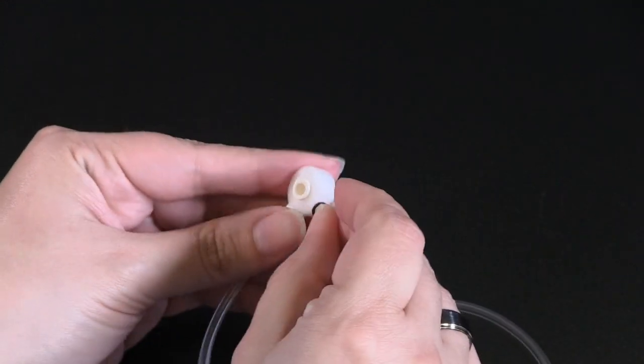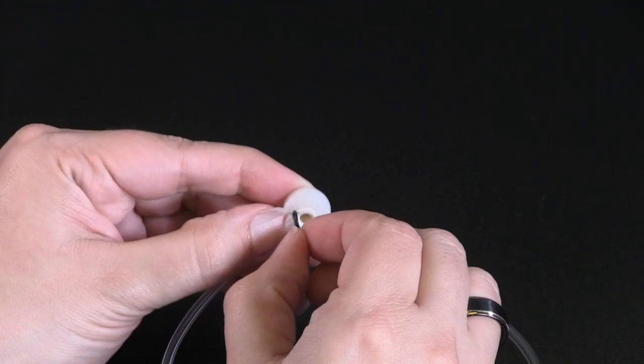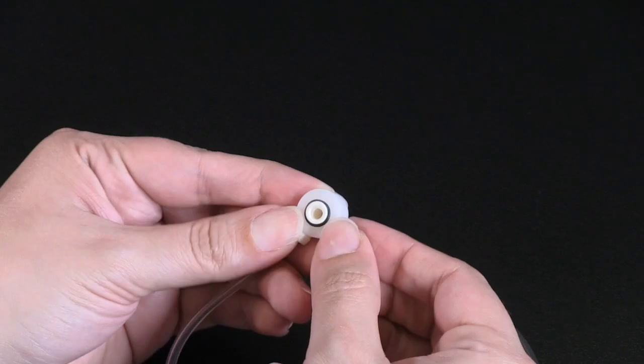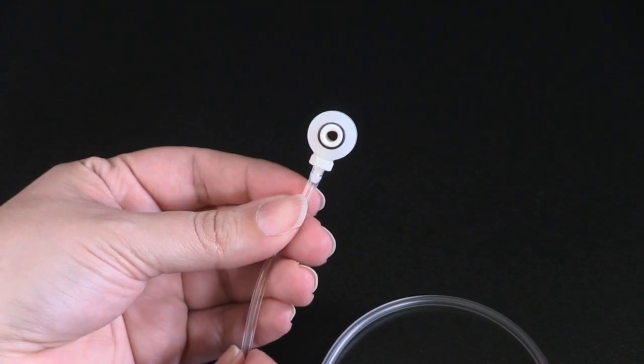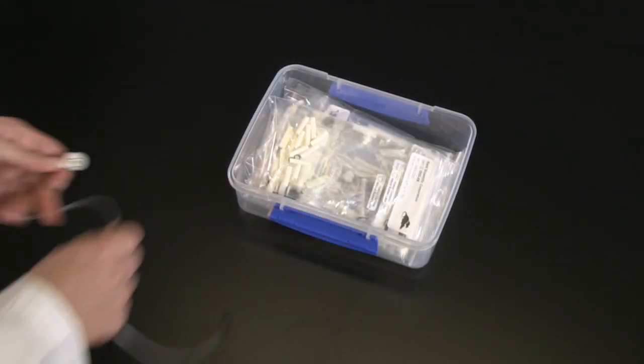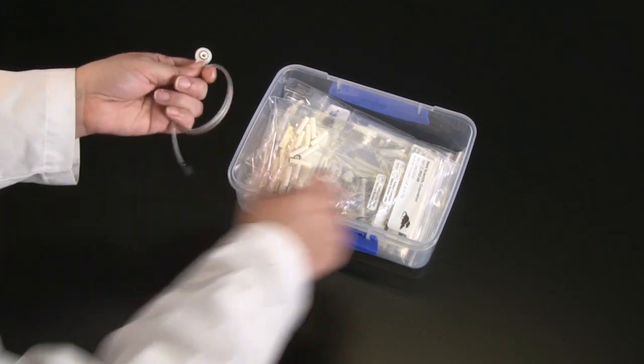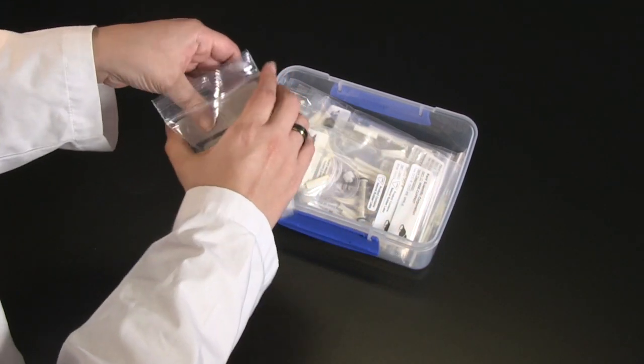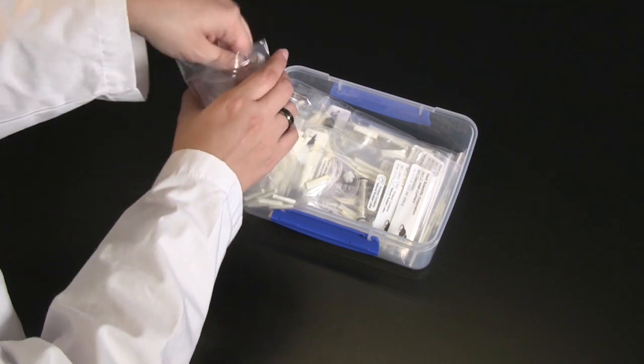Proper cuff and bladder maintenance is a critical step in maintaining your CODA non-invasive blood pressure system. To extend the lifespan of your cuffs and bladders, store them in an airtight container away from excess heat, humidity, and light when your CODA system is not in use.